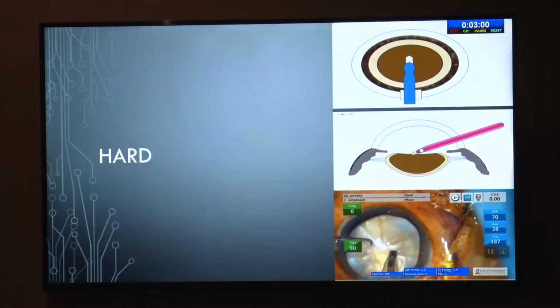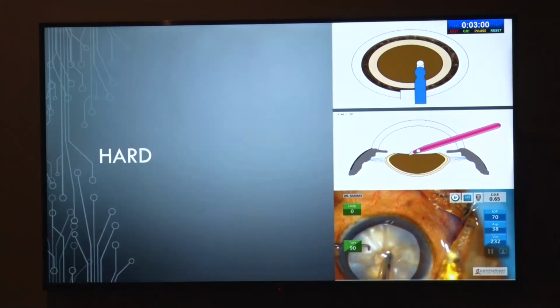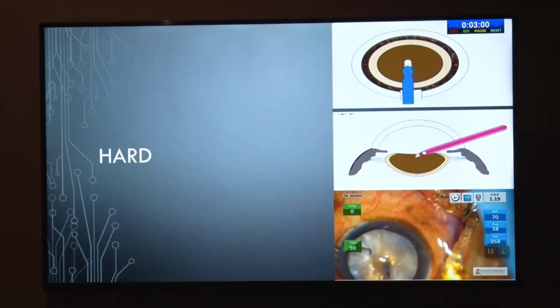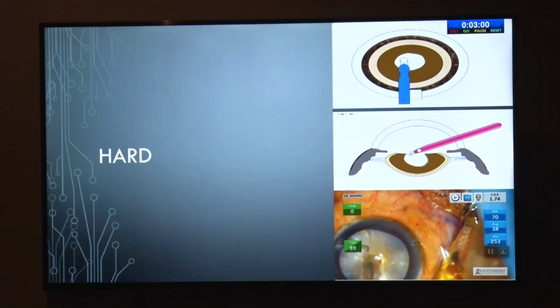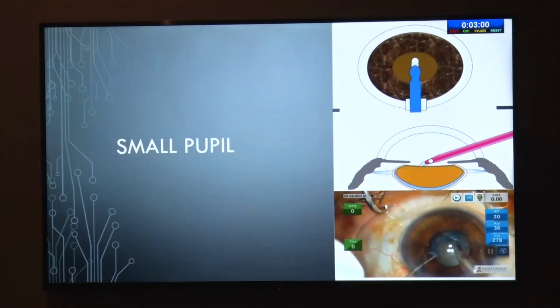Now comes the white cataract. It is definitely a very hard cataract, but yes, you can follow the same principles according to your suitability, size of the crater and the depth of the crater. You have enough size to see where you have to impinge and break the nucleus.